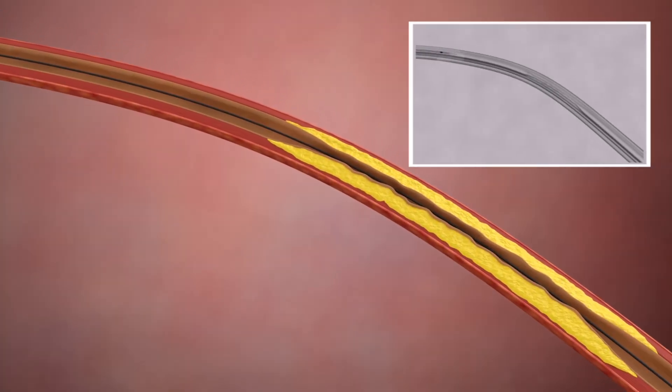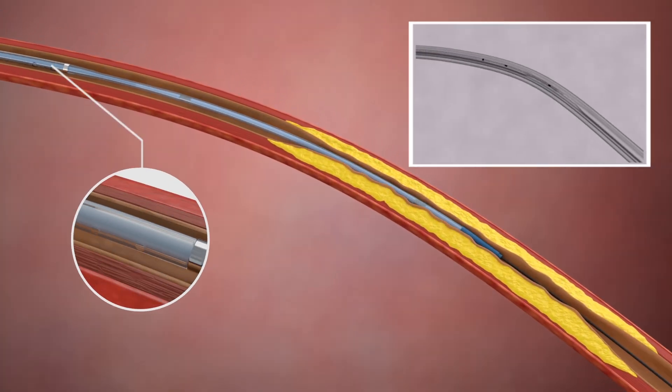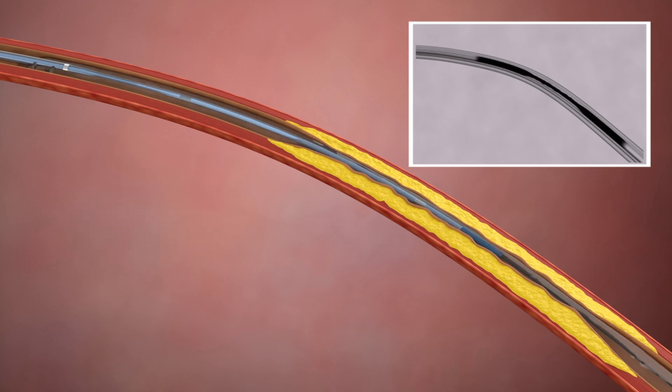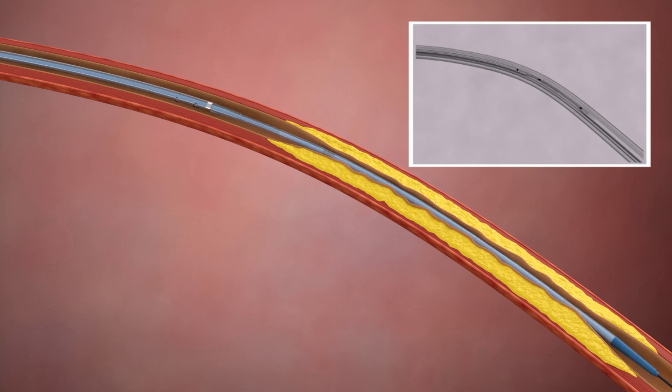Once selectively positioned, contrast can be injected to perform angiography. The guide wire and catheter are manipulated through the occlusive lesion and angioplasty is performed.